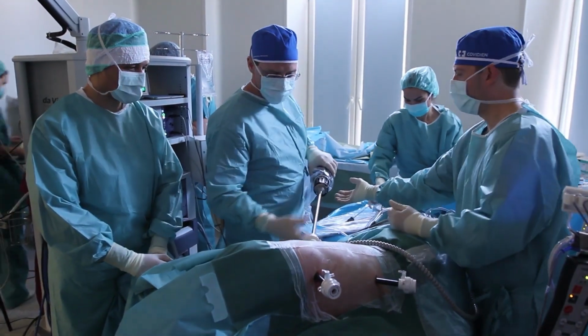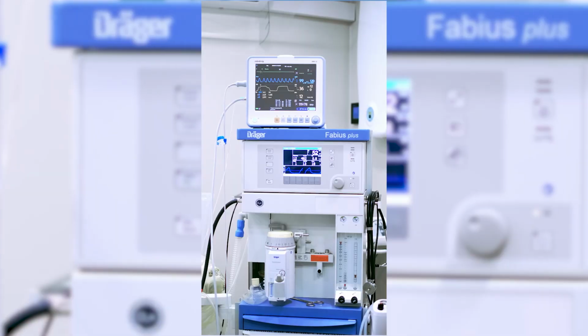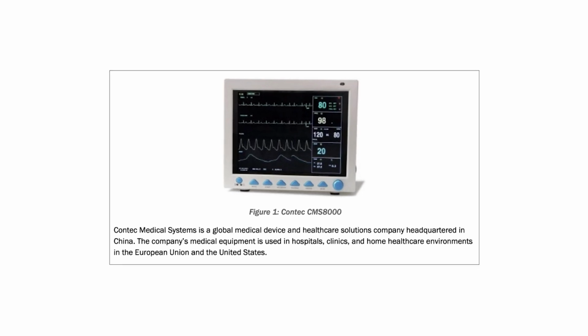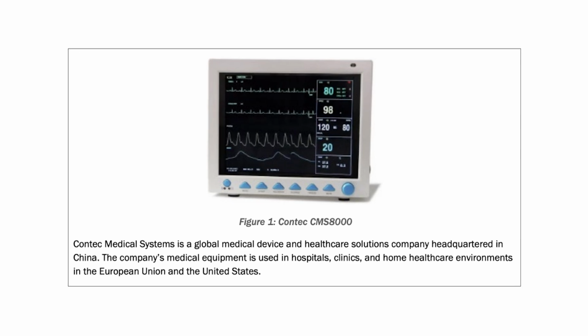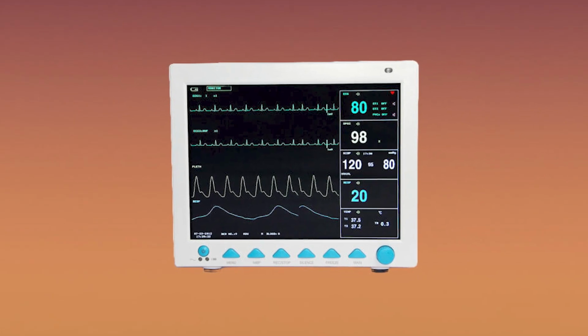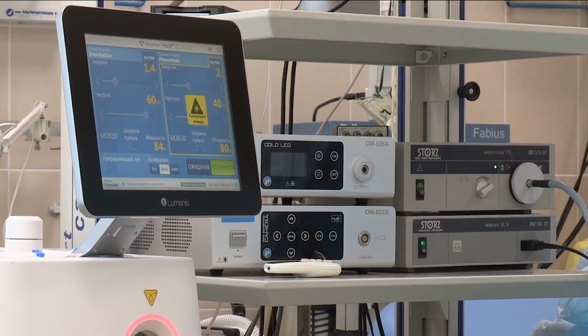The backdoor allows for remote code execution and device modification, unauthorized transmission of patient data to hard-coded IP addresses, and downloading and executing binary files without authorization. This vulnerability affects not only the Contec CMS 8000, but also its rebranded version, the EPSIMED MN12023.